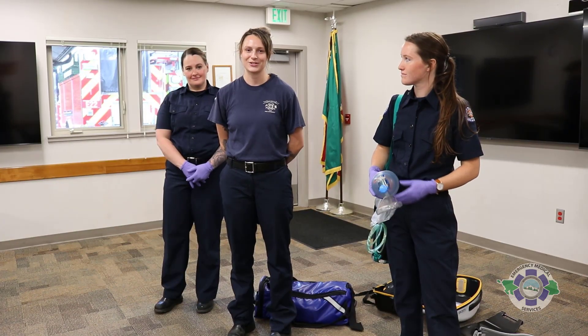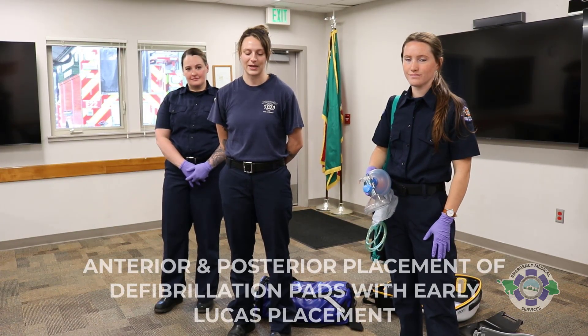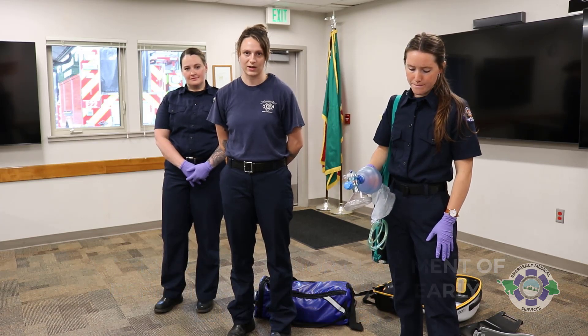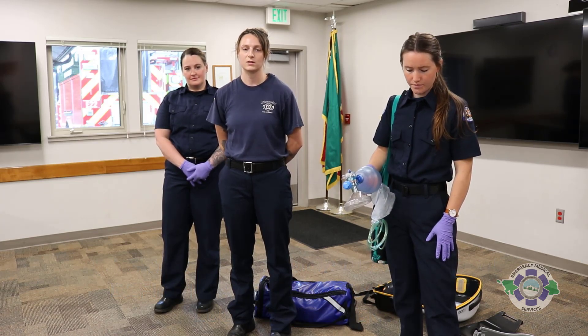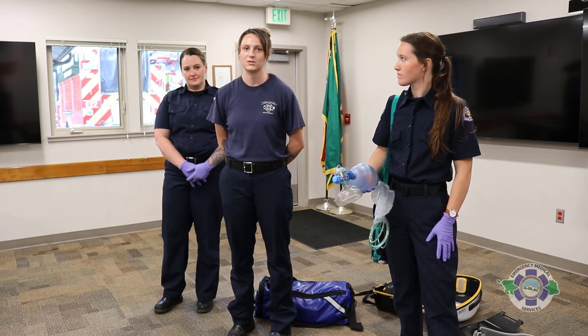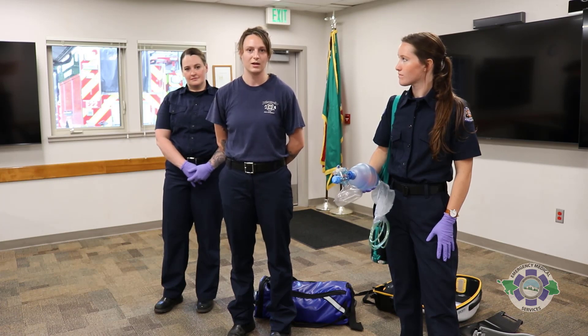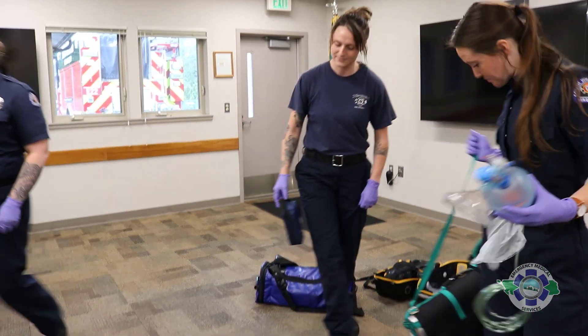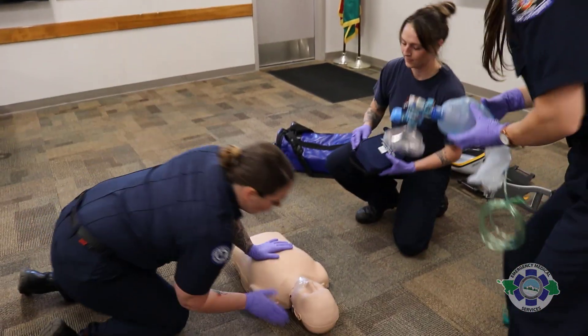This is a training simulation to show anterior-posterior AED placement in conjunction with the Lucas device. In certain parts of our county there will be fewer resources, so the Lucas device may be put in a little bit earlier than in other parts of the county. Here we go — are you okay?